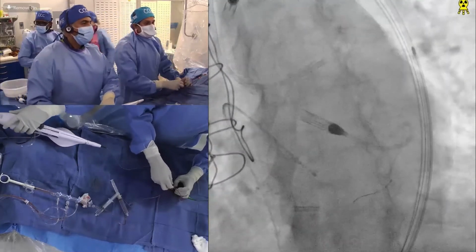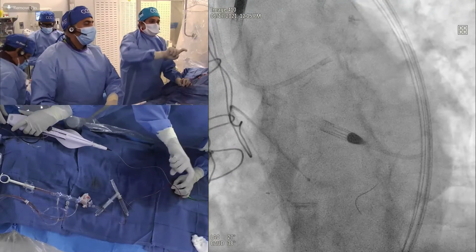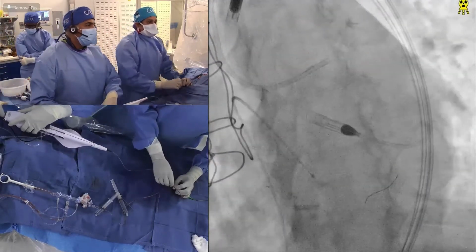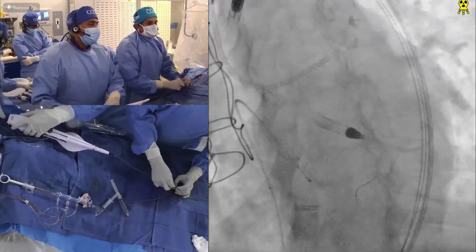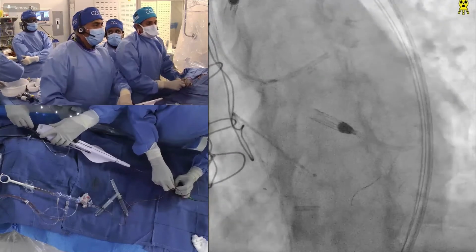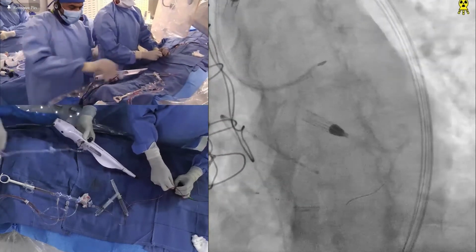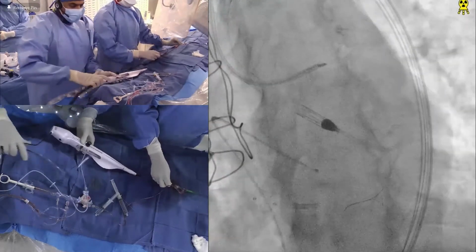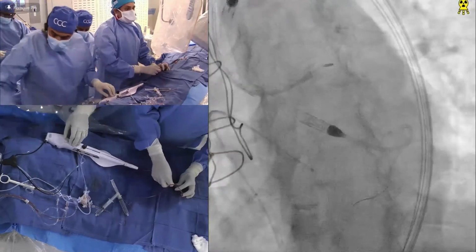I called for a Miracle wire only because with Miracle you are able to make a curve and get into the circumflex. Now the Gaia family, which has come with the Gaia Next, are very good wires, but they come with a pre-made curve and it's not easy to make an extra curve on those wires. And if you make an extra curve, it's not able to navigate well.